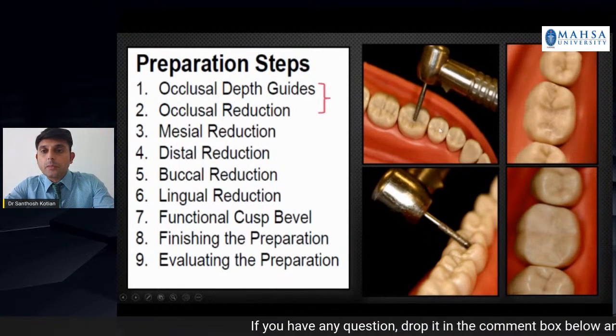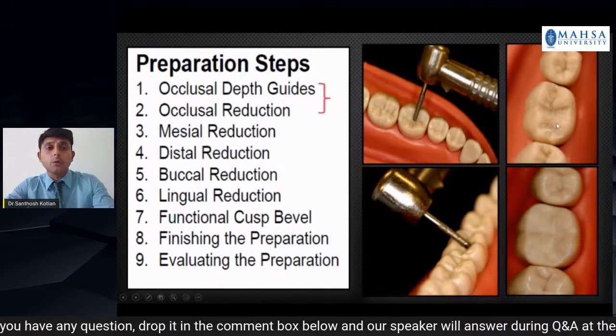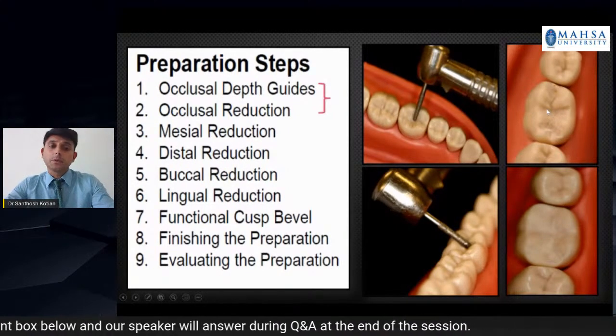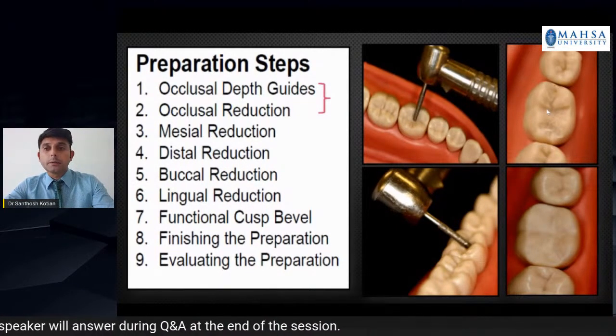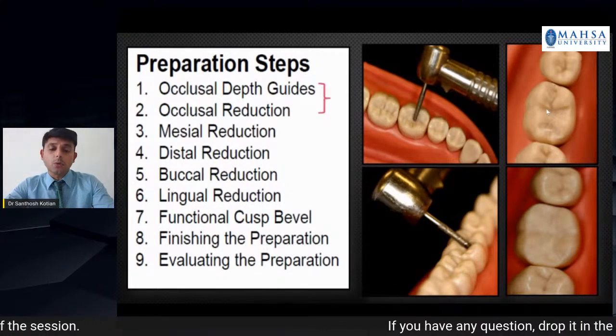And make the depth orientation grooves. Do not overlook this depth. Even now, after 14 years of experience, I still do depth orientation grooves. Okay, so it really helps you to do a uniform reduction, and you don't over prepare.